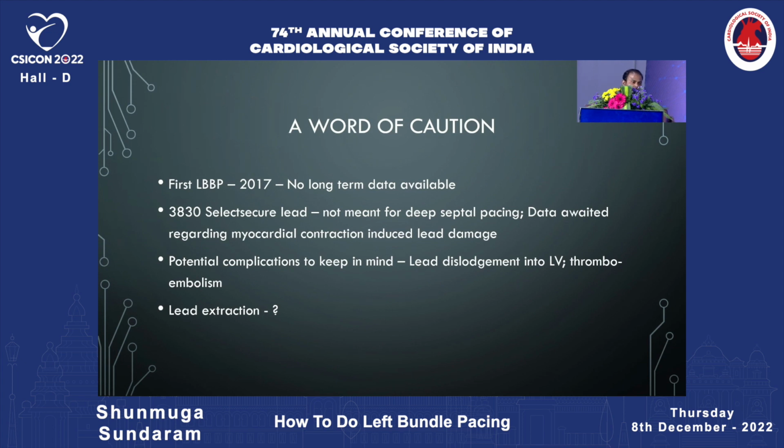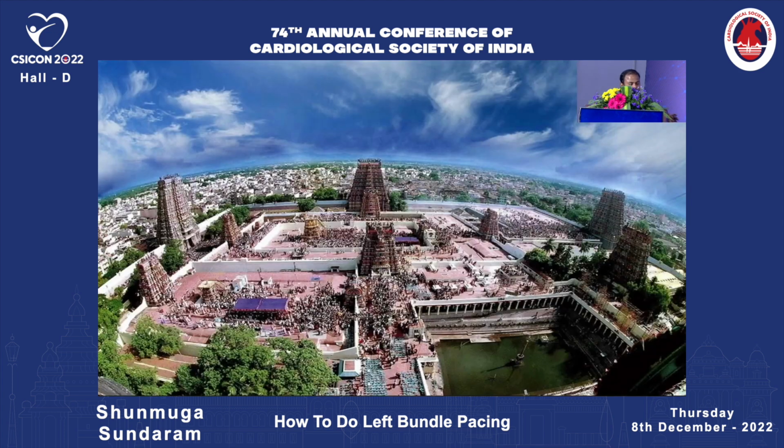And the HRS and APHRS are going to release the guidelines in another 3 or 4 months, where probably a class 2 or class 2B indication will be given for left bundle pacing. Till then, we have to be very careful in choosing the patient. We have to explain to the patient the full procedure and its consequences, and we can do better for the patient.